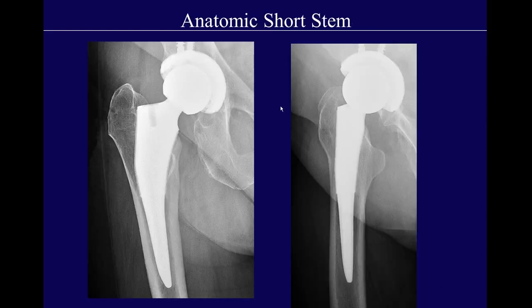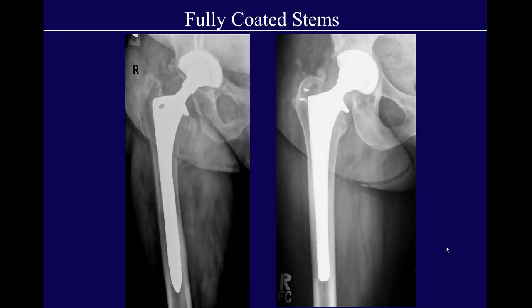This is an example of the anatomic short stem. You can see the metaphyseal region where ingrowth will take place, and notice that it's curved in the AP plane, matching the shape of the proximal femur. This is an example of a cylindrical fully coated stem — notice that the textured surface goes all the way down, there are no slots or flutes, and these are done for cases of revision.